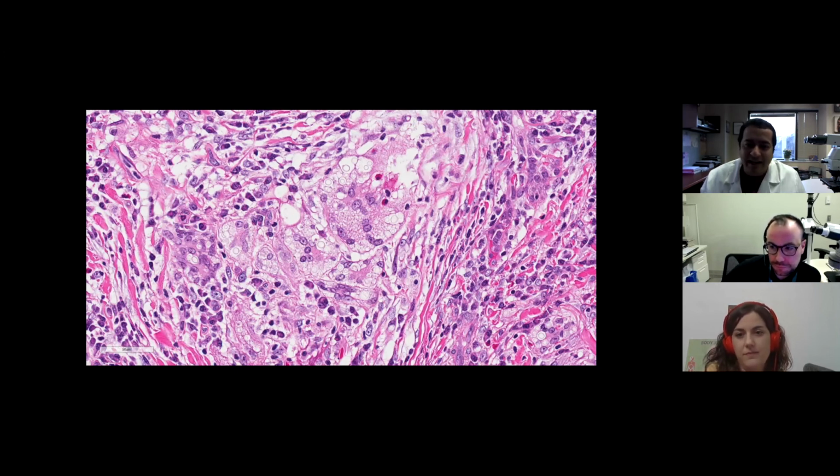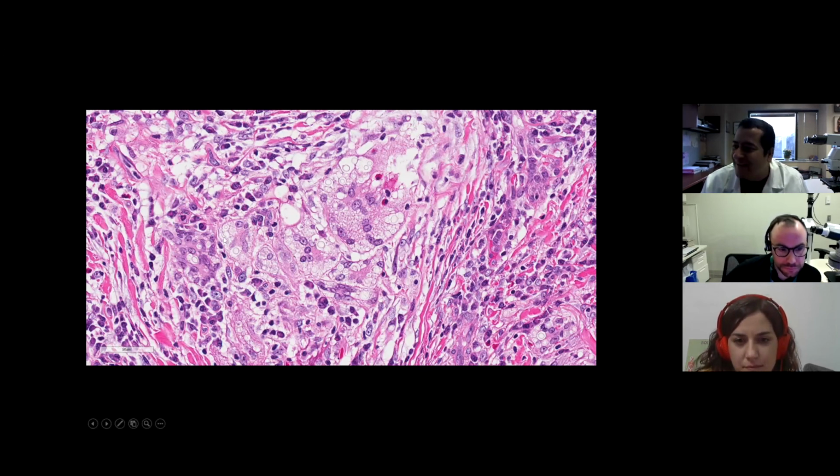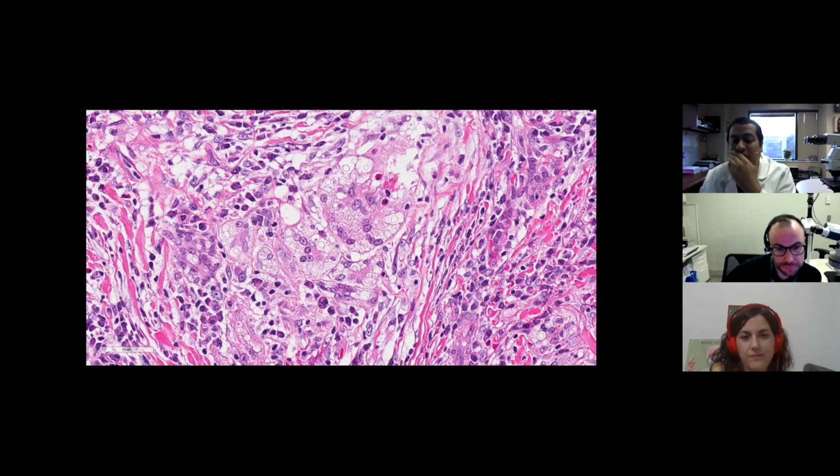Great point. But I'll show you one thing, Irene, just as a side note. See that organism? It has a little bit of that helmet shape of pneumocystis. But of course, you would never mistake it for that because of the H&E morphology. You can see there's none of the froth with dots kind of thing. And of course, good to remember that this organism also shows narrow base budding, just like histoplasma.